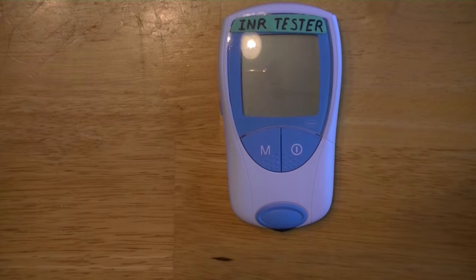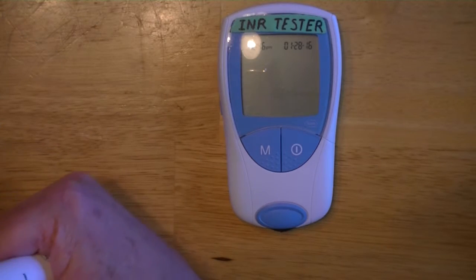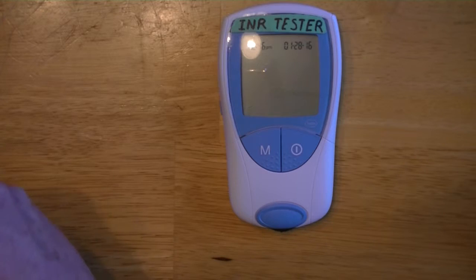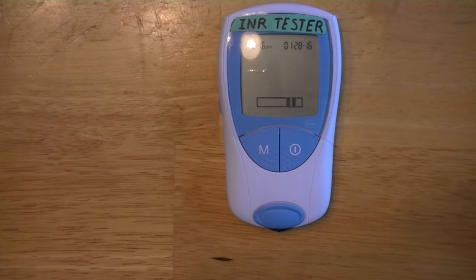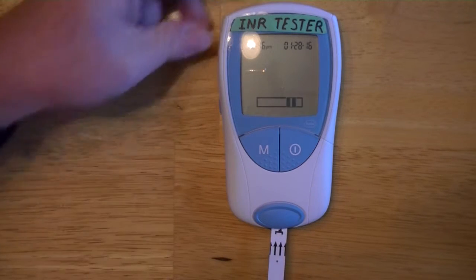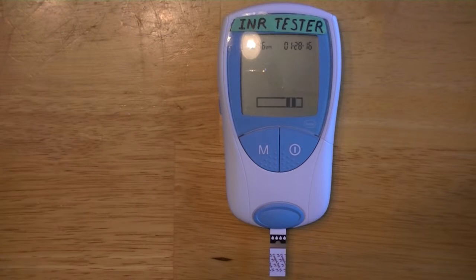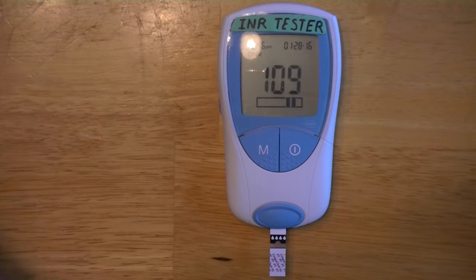To begin, you turn on the unit and wait for it to flash, then open up your little bottle of strips. Your strips may be different than the ones I'm using. You'll notice there are little arrows — you stick the strip into the slot in the front and it should beep and display a number that should match the number on your strips, which it does, so we're good.